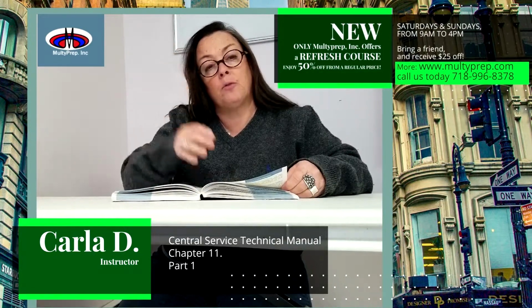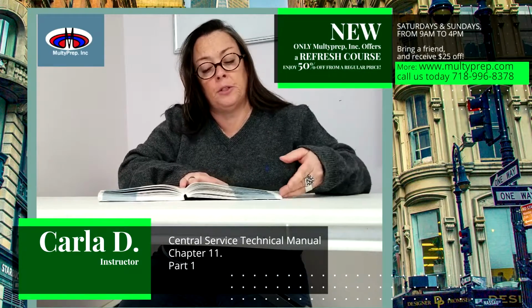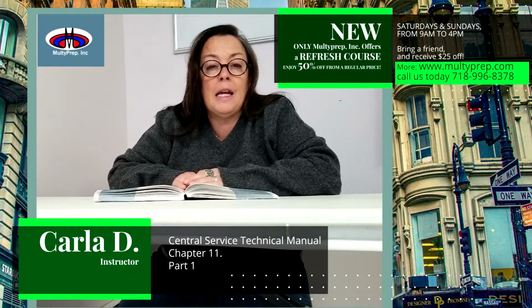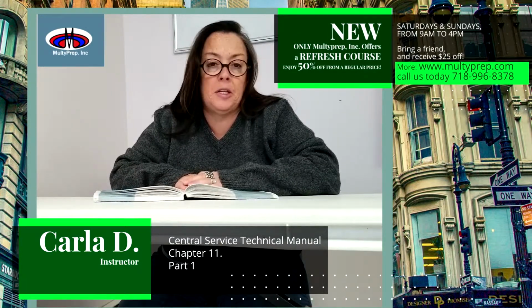The following are general guidelines for proper care and handling of electrical powered instruments and accessories. Do not immerse the equipment in any solution, including water, unless the manufacturer's instructions for use specifically state that the device can be submerged. Do not use solvents or lubricants unless specified by the equipment manufacturer. Use a brush to clean the distal tip and lumens. Follow the instructions for use for the correct size and type of brush to use for each area. Finally, dry the equipment with a clean, lint-free cloth.